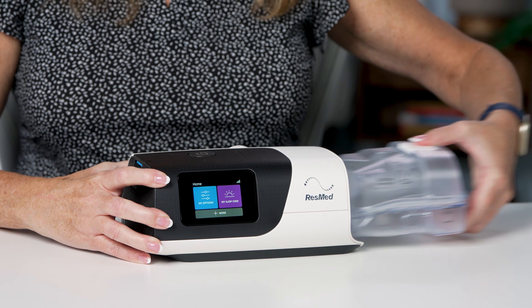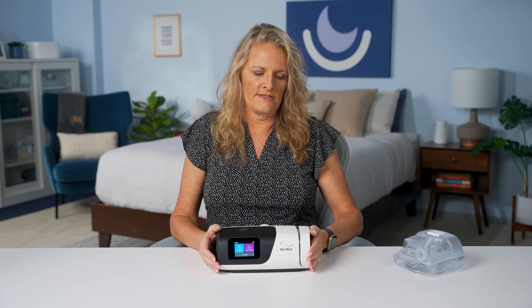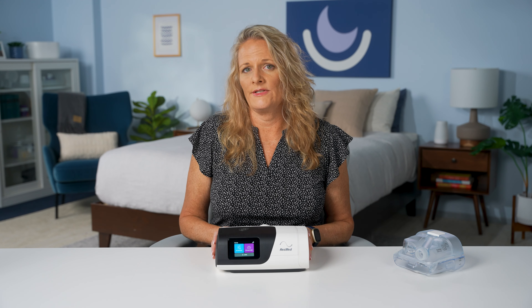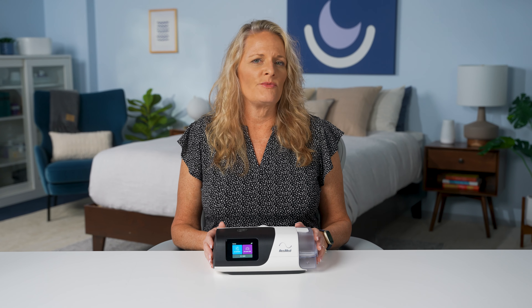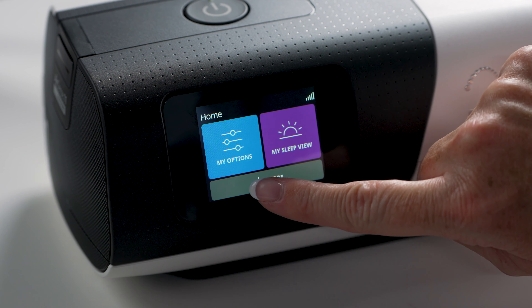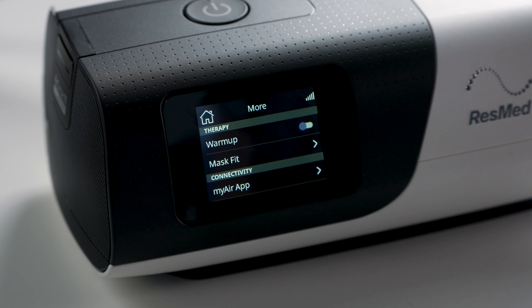The AirSense 11 doesn't come standard with an SD card in place because it is transmitting that data remotely. However, some people choose to have an SD card for their data purposes. You can put one into this machine. To do so, you simply push in on this little button here on the end and remove this piece. Now your SD card can pop right in and it's in place, recording as well.